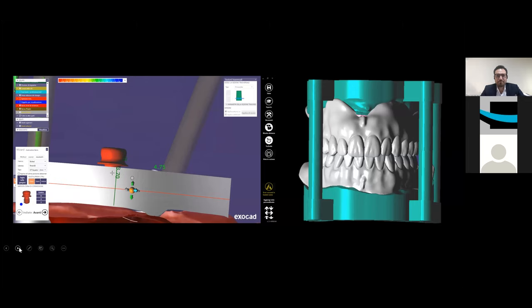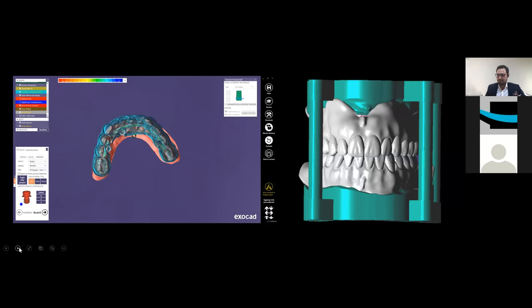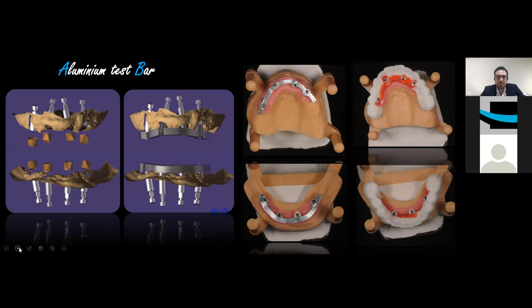Because in this case we want to make two overdentures, but the workflow is the same for fixed prosthesis. It doesn't change the workflow. If you want another prosthesis, it doesn't change the workflow. It's the same, okay? This is my choice to have two overdentures on this patient. I believe in the digital impression, but I want to check, like in the analog system: if you take an impression of four implants for a bar, you have to fit your bar inside the mouth. You have to check everything.